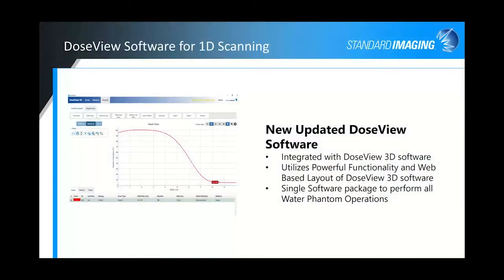But today, like I said, I want to focus on the DoseView software for our 1D water phantom. It's a brand new reimagined software for our 1D. I don't know if any of you have familiarity with the existing software, but it was very basic in scope, and we've added a lot of good functionality and feature sets to the new software that really will make it much easier to perform the scans and do your dose conversions, produce those PDD tables, things like that are all incorporated into the new software.